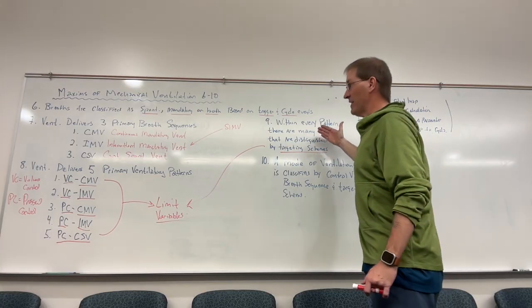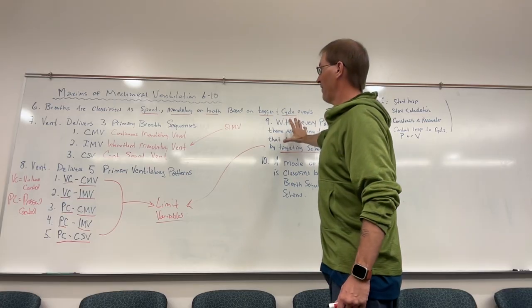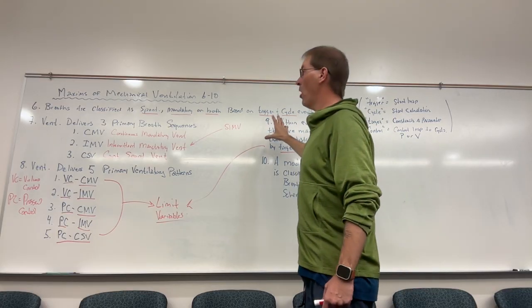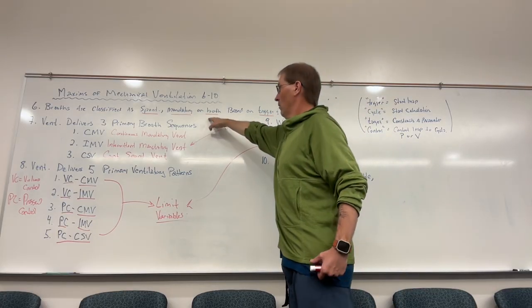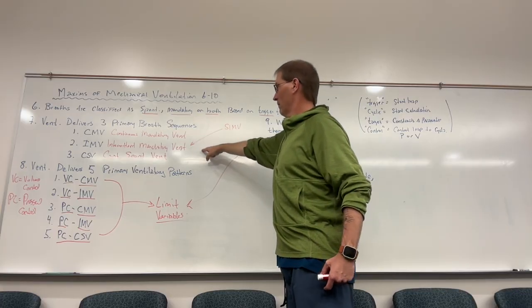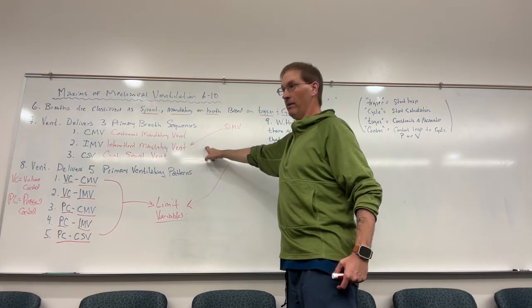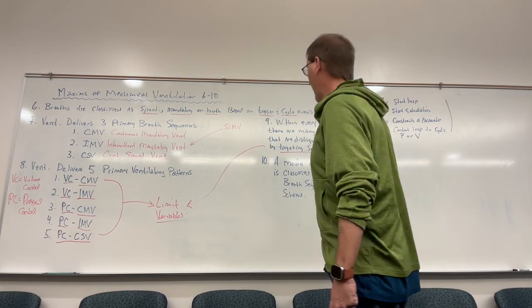But at the end of the day, regardless of this, whatever that mode is, what breaths are being delivered, what primary breath sequences are being delivered, and what are the ventilatory patterns.